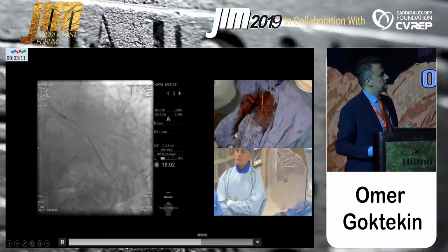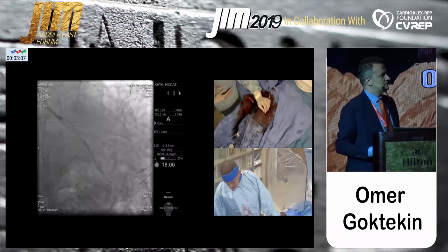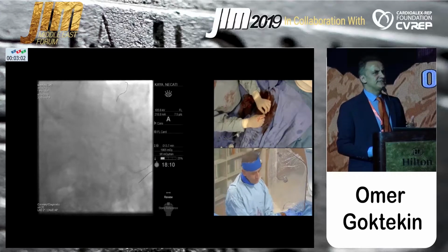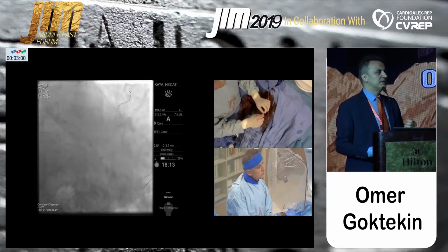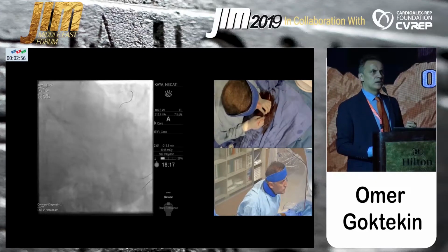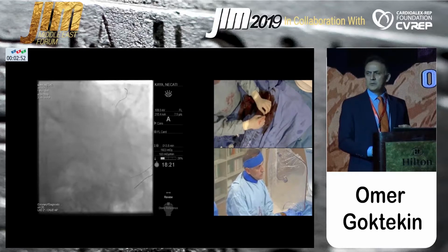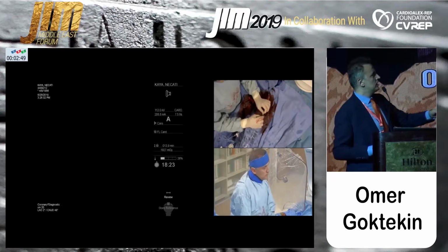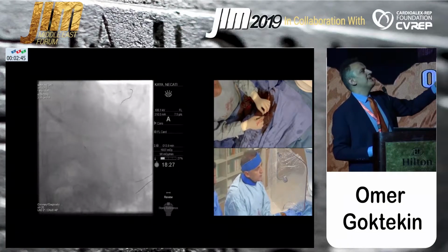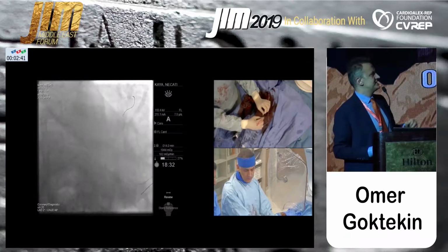This is 2.5 by 38. We wait sometimes like 10 to 15 seconds, but we do always post-dilatation. To the nominal. Sorry? To the nominal. You do the stent to the nominal. Yes, nominal, but we will always do. Yes, yes. Now I pull it a little bit back and I inflated it again, up to 16 in this case.